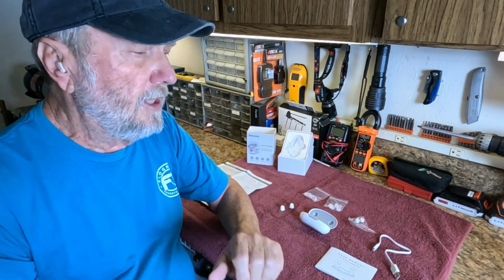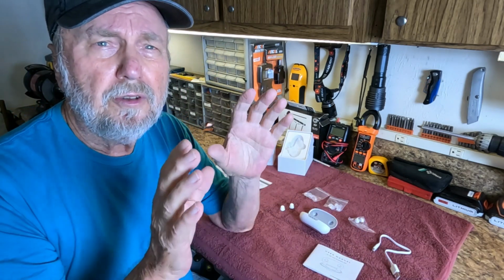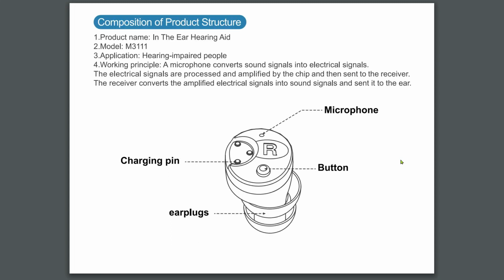Let me go to the screenshot and go into detail in the user manual to show you some of this stuff close up. And right here are the earpieces marked left and right, and there's those 2 monitor buttons that if they're green, they're charging. And here's the 3 monitors on the front for the battery and charging. Right here is the model number, and here are the 3 contacts that I told you about that have to meet up with the charging box.